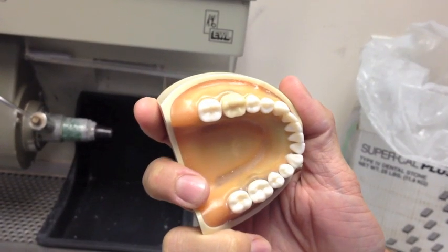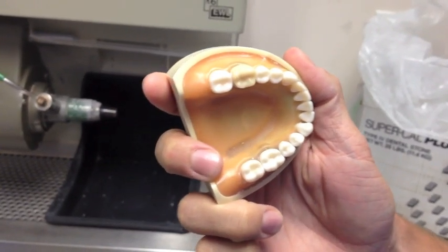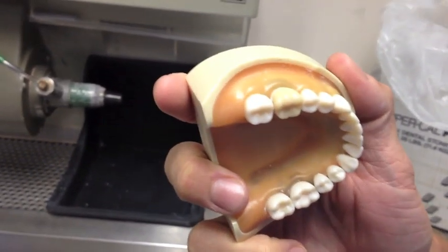The final product: a provisionalized number 19. Using Dr. Donaldson's method and proper pumicing, it's easy to come up with a beautiful, smooth finish.